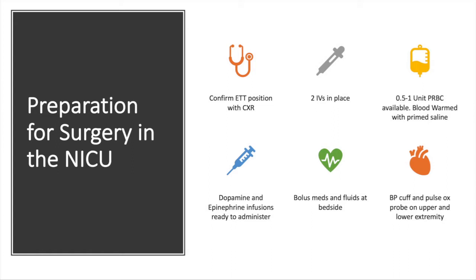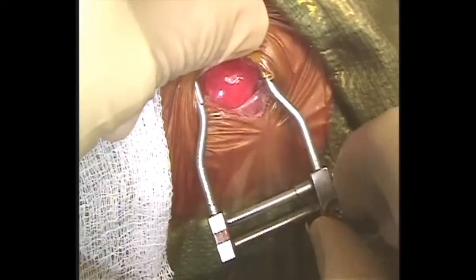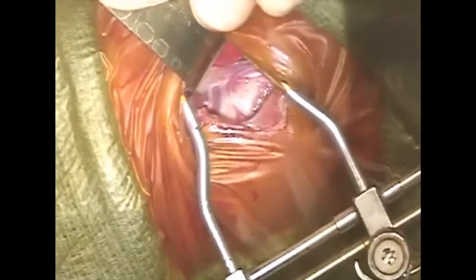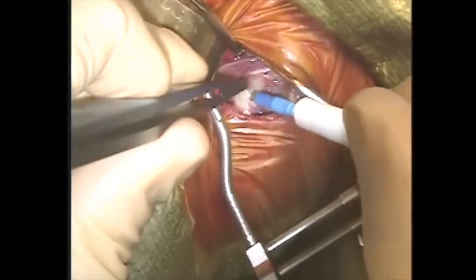After setup is confirmed, the patient is placed in the right lateral decubitus position for a posterior lateral left thoracotomy. The incision is placed directly underneath the scapula, approximately one and a half centimeters in size. A muscle-sparing thoracotomy is performed through the third intercostal space. A malleable retractor is used to mobilize the left lung anteriorly, and the anesthesiologist usually does not have difficulty with ventilation. The pericardium is identified and dissected with electrocautery.